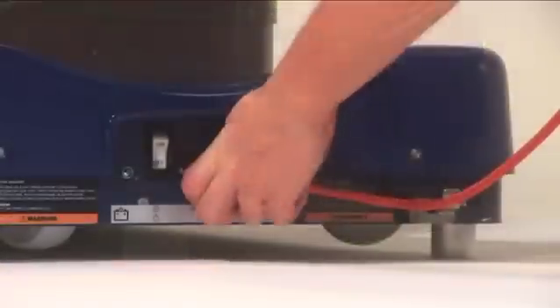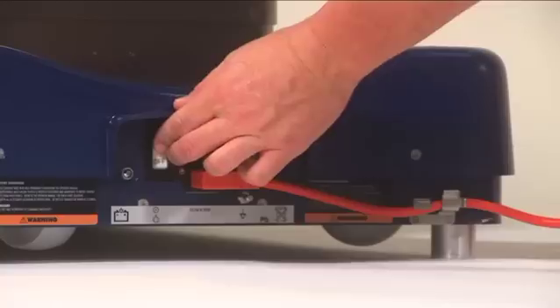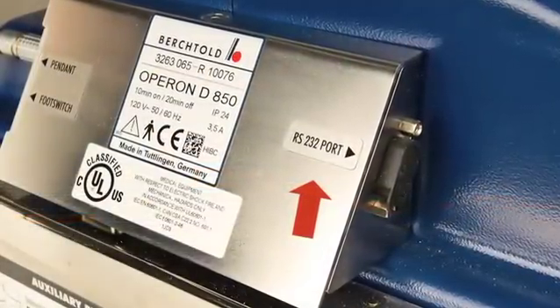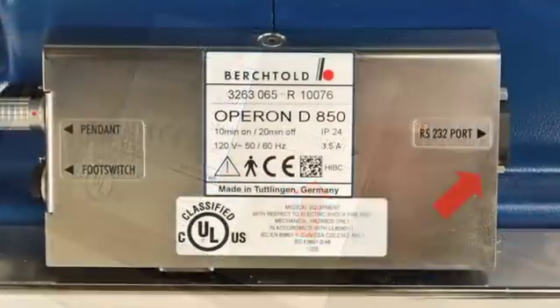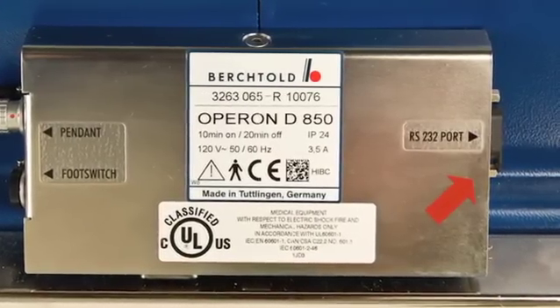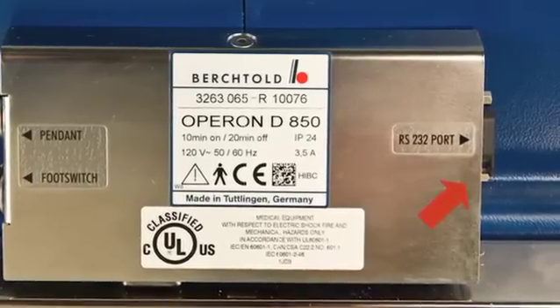The main power switch, power cord plug, and grounding post are found at the base of the table. The RS232 port can be found to the right of the hand pendant port. The RS232 port allows biomedical staff to electronically diagnose issues using the D850's troubleshooting software.